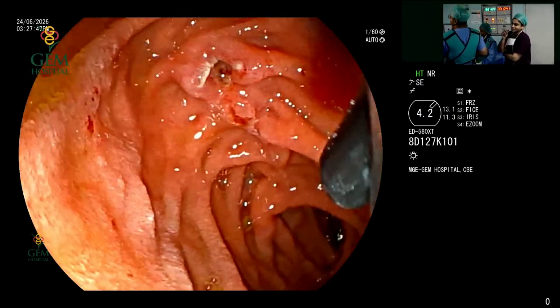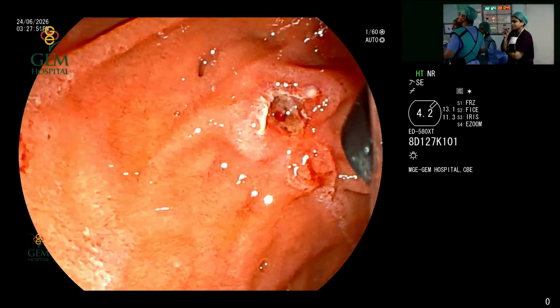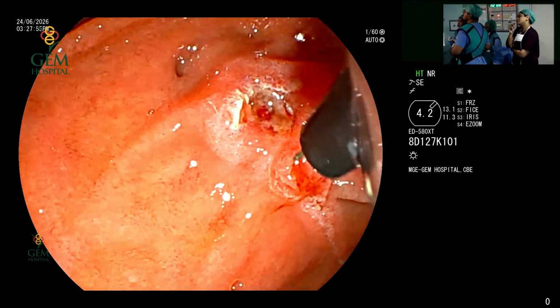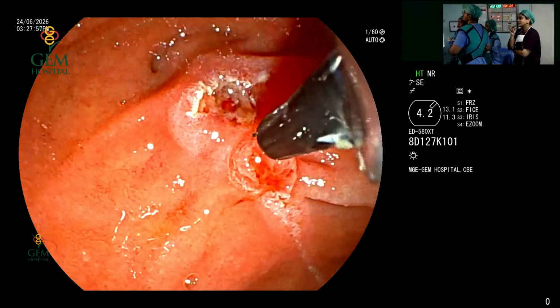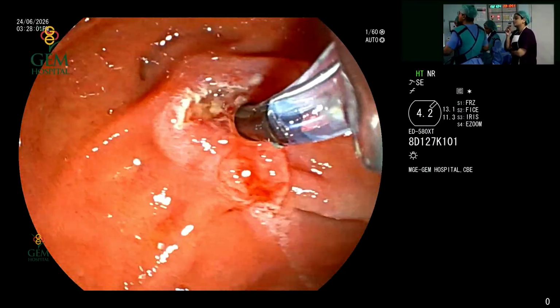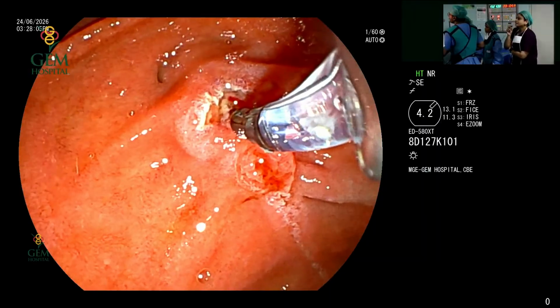Whenever the CBD caliber is normal, the cannulation itself becomes a bit difficult because we have a collapsed biliary system which is already decompressed as the calculi has passed out. And in the background, we had already mentioned to you that it is a case of post cholecystectomy, where the gallbladder is absent for the patient.